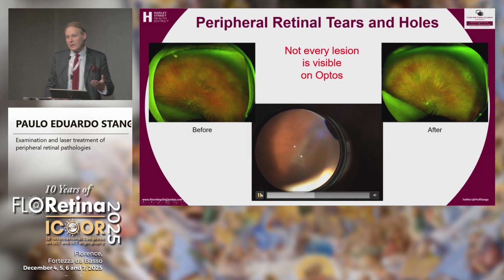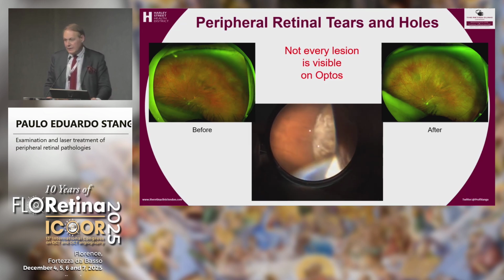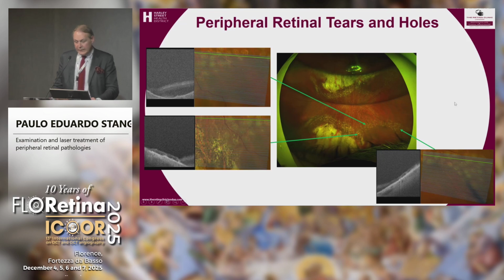And this is easier for the patient. A drop of topical anesthesia, there's no gunky stuff, nothing, no contact lens, no red eye. They can even wear a contact lens straight after. Very, very straightforward.